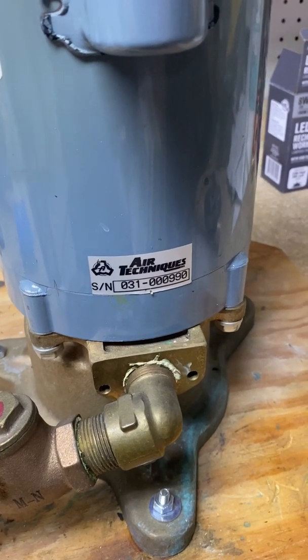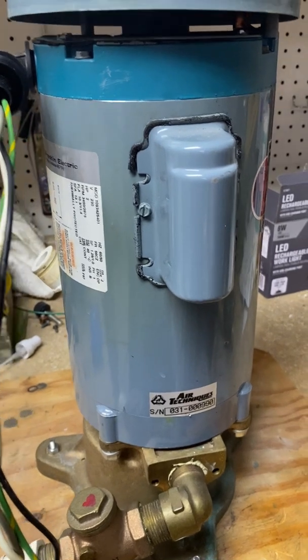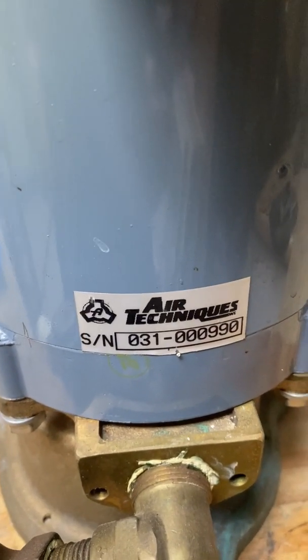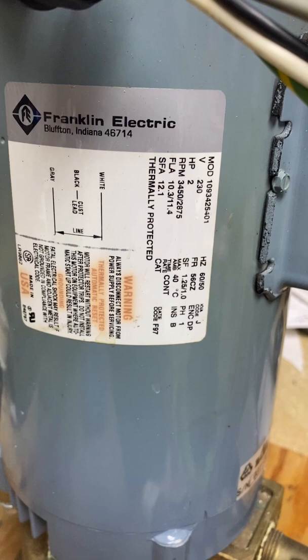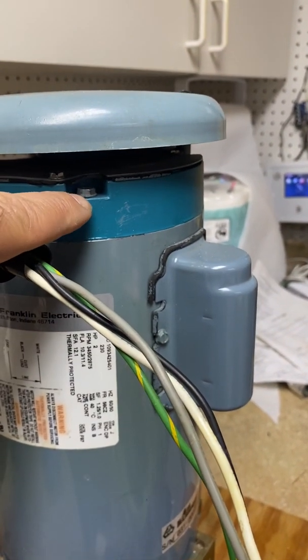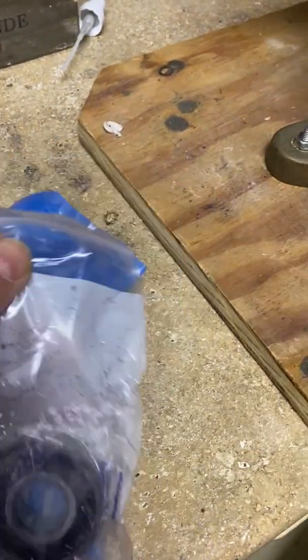Hey YouTube! Today we're going to rebuild this motor from an Air Techniques Vacstar 80 vacuum pump. This is a 2 horsepower Franklin electric motor and basically there are two bearings on the drive shaft — one at the top and one at the bottom. We're going to replace both of those bearings with new bearings.